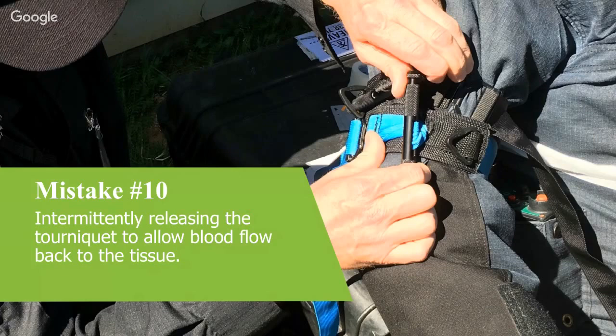If it's not possible for you to monitor the bleed, then you don't convert it to a hemostatic dressing. So don't change it to a hemostatic dressing, take the tourniquet off, and then have to walk off. Or if you can't keep an eye on that and be sure that you can be there if it rebleeds and put another tourniquet on, then don't remove it. And also, if the limb's been amputated, if the limb is missing, then the tourniquet stays on. You don't try and convert that one to a pressure dressing. You just leave it on, get them to surgery.